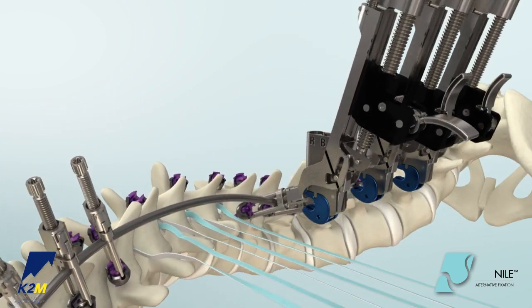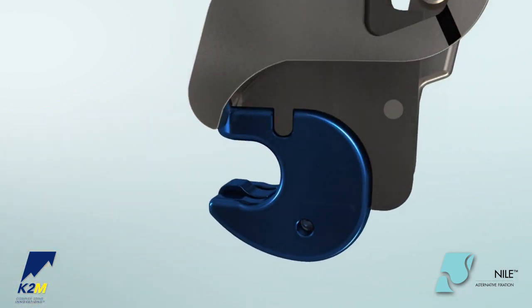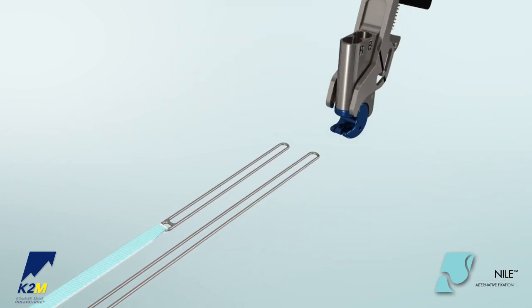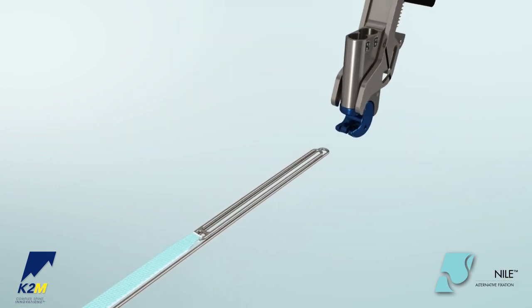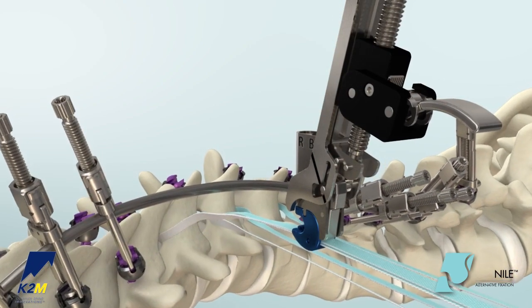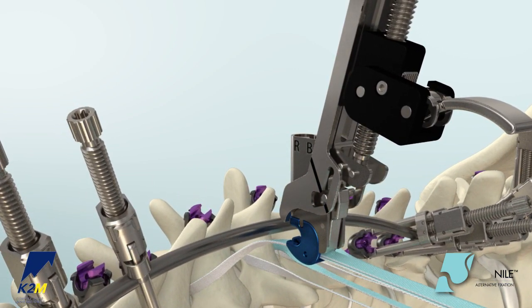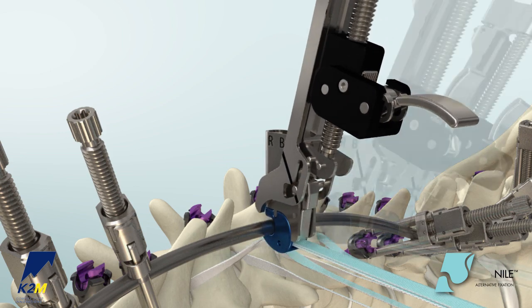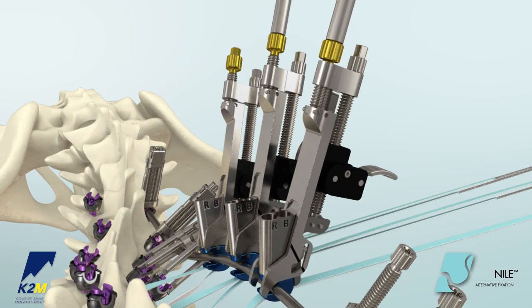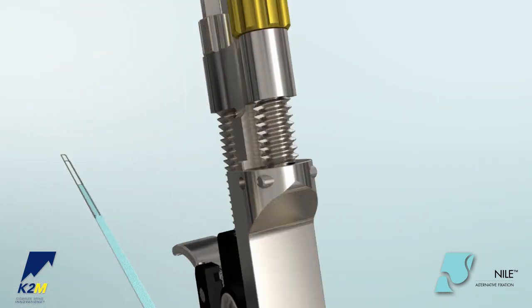Once all the clamps are attached to the tensioners, pass the bands through each clamp. To ensure smooth passage of the bands through the clamp, confirm that the band set screw is raised. Ensure that both leaders are straight and stack them on top of one another. Pass both leaders simultaneously through the clamp from the open end. Hold the distal ends of the band with one hand applying slight tension and slide the clamp tensioner assembly down along the band toward the rod. Push the clamp onto the rod. An audible click will be heard when the clamp is properly engaged. Reduce the claw of the tensioner by turning the gold knob clockwise until tight. This will secure the clamp onto the rod.